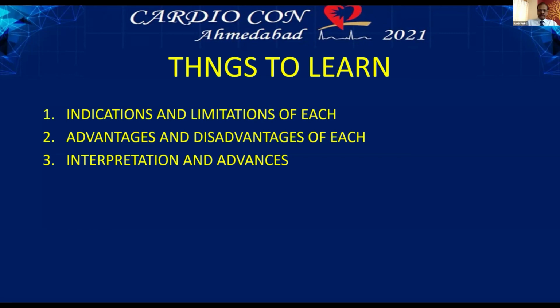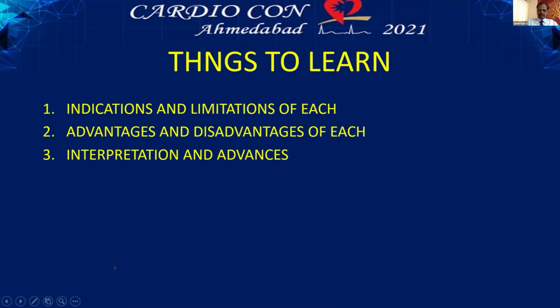So thank you, Dr. Mahesh. All of us will agree that we had a great time of discussion. The essential take-home points that we have had is we understood the indications of this imaging. All of us agree that this case definitely needs a form of imaging. And we always choose the imaging which we are comfortable with personally and we are well versed with. And it is always good to use both IVUS and OCT in a complementary way, understanding the limitations of each.